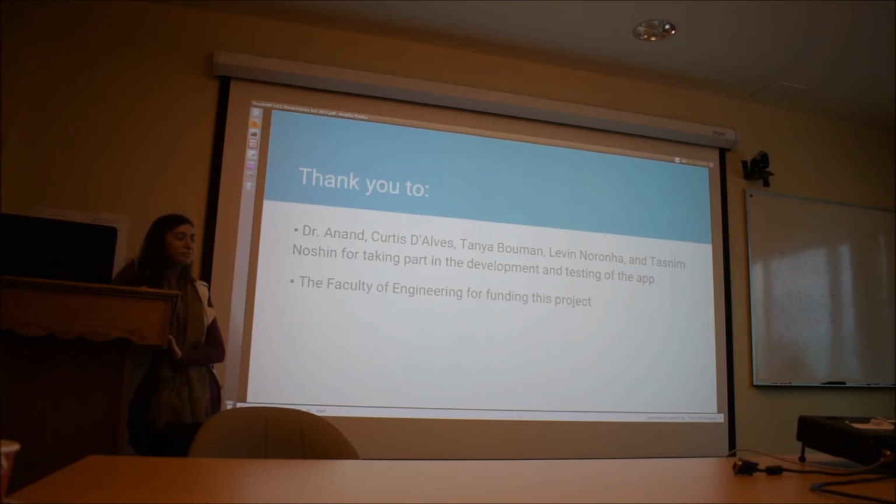Do you think it's tedious for a machine to sample k-space as well? Yes. If they wanted to sample all of it, it would take an outrageously long time. You'd have to sit in an MRI all day and night. Do MRIs use different sampling patterns? When you tap in the middle of k-space, what happens? You get the general overview of the actual image.